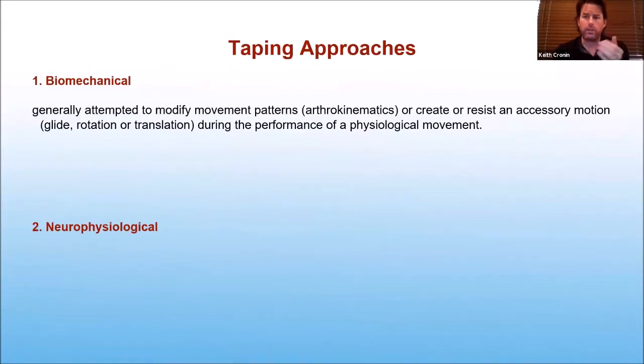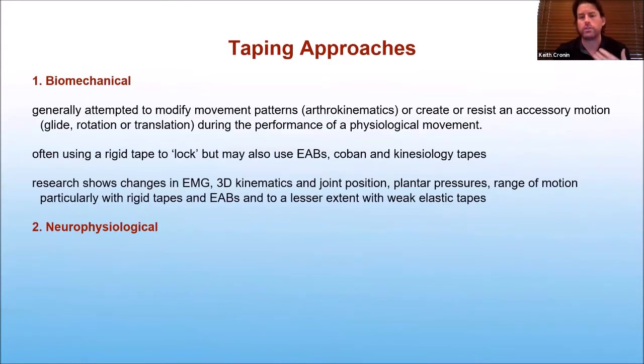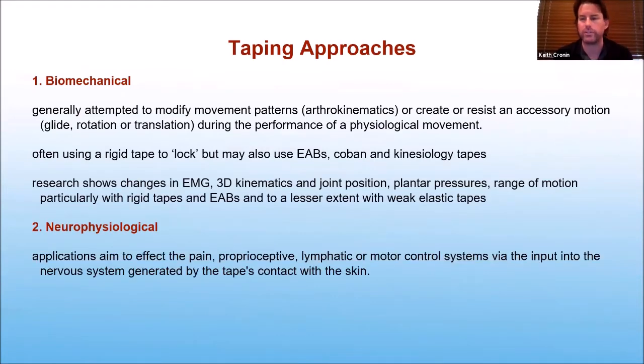Now, when we use the tools, it gets us to a point where we go, okay, so what are we going to do with these things? We've done the tool part, great. Well, now we need to do managing motion, right? So why this segues into biomechanical tape is because we've done things with our hands and our tools to be able to break stuff up. We've gone through our treatment options. We've done our dynamic stretching. We've done all those types of things. The problem now is we have weakened tissue that is not working appropriately, and this takes time, and we know that as clinicians. So what does a biomechanical approach to taping do? Well, it takes the load out of the body.